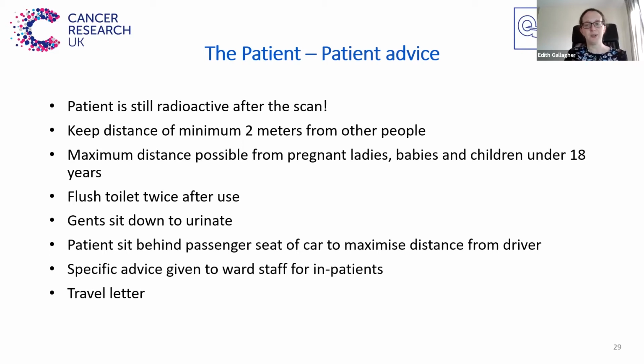For an inpatient, ward staff will be advised to keep their distance as much as possible and to store any linen or waste items in a separate area for a designated length of time before they can be disposed of, which is to allow for any possible radioactive contamination to have decreased to safe levels. Patients will be advised the time that they will stop being radioactive at. If they were traveling abroad in the days following the procedure, patients are provided with a letter detailing the injection they had in case it alarms any radiation detectors in the airport.